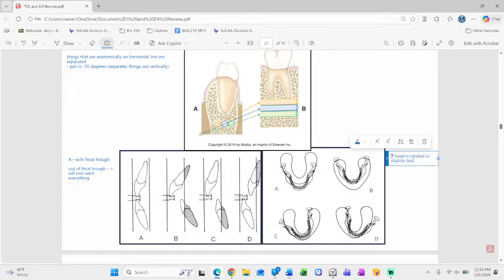That can either be that the teeth have moved off of the bite stick and they can be forward of the groove or back of the groove, or the teeth are perfect in the notch of the bite stick, but the light was placed too far forward, too far back, same results. So it doesn't always happen just because the patient's teeth aren't in the groove. It can happen because of where the light then was placed.